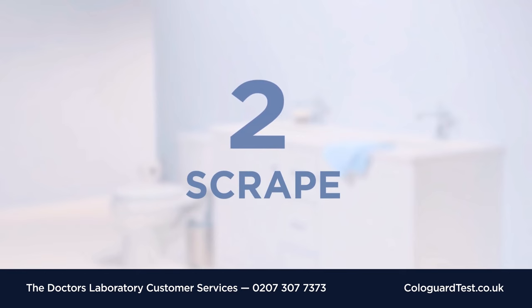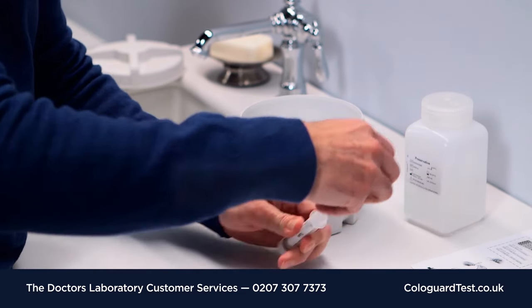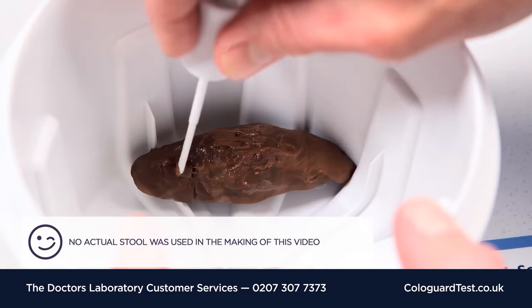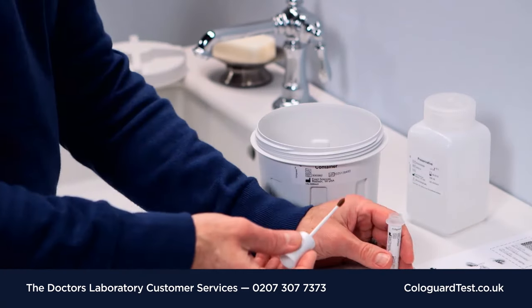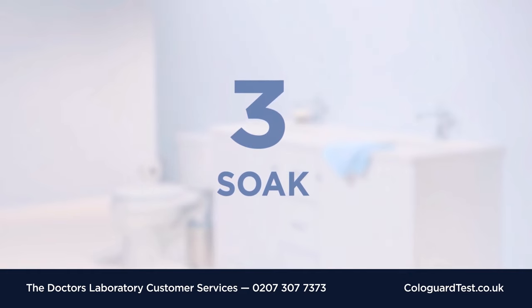Step 2. Open the small plastic tube by unscrewing the cap and pulling out the probe. Scrape the surface of the stool sample until part of the sample lightly covers the end of the probe. Then place the probe back into the open end of the tube and screw on the cap to close.